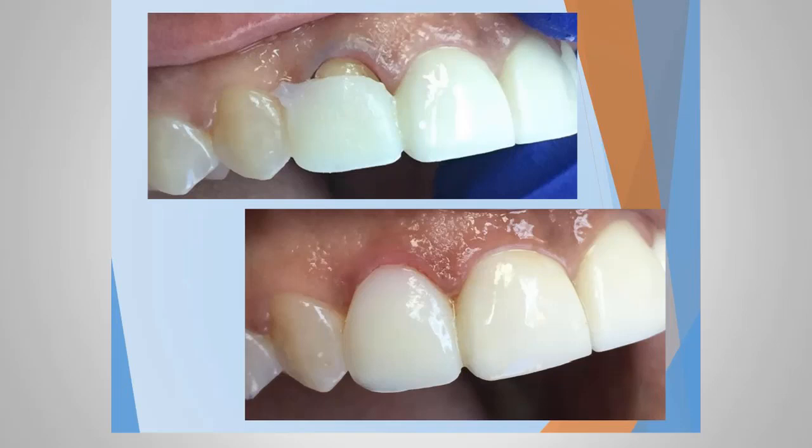However, in placing the temporary material, I didn't put enough material inside the matrix, and I got this type of temporary. Now at this point, I had some options on how I could handle it. I could maybe just trim everything back on the side like normal, and then cement this, and then go back and add some composite to kind of fill in and cover this margin. That would be one option.